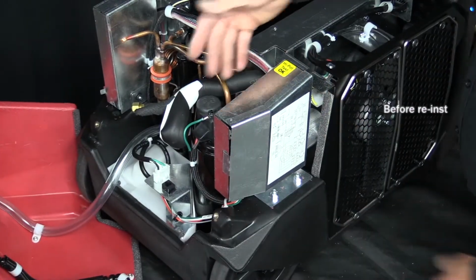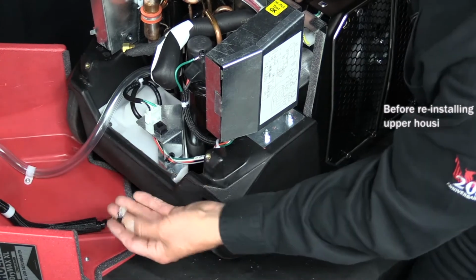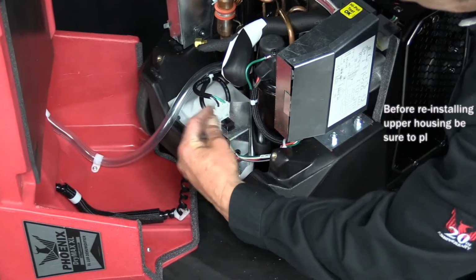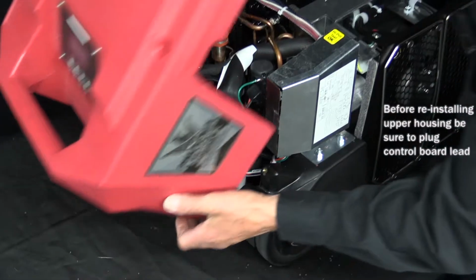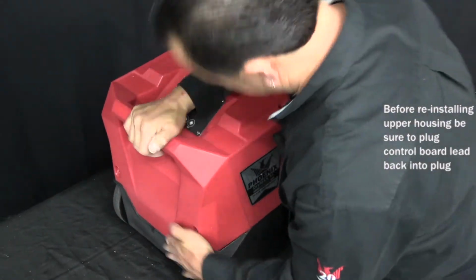So after all of that, we need to reinstall the upper housing. First thing we needed to remember is to plug in the lead that goes to the control board into this plug here on that bracket. So once we plug that in, we can take the front cover and slide it back onto the unit.